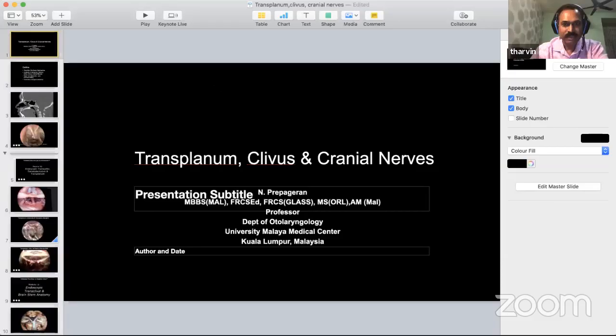Keep in mind that what we are going to do is show videos regarding anatomical aspects inside of the nose through an endoscopic view. Professor Prepageran, I'll leave the torch to you. Please share your screen.